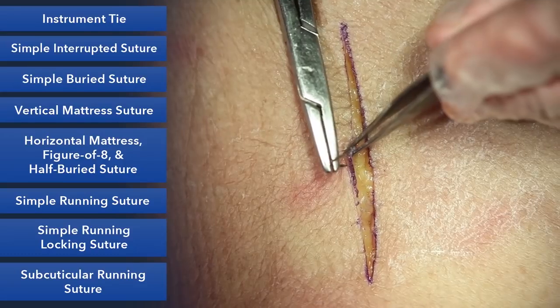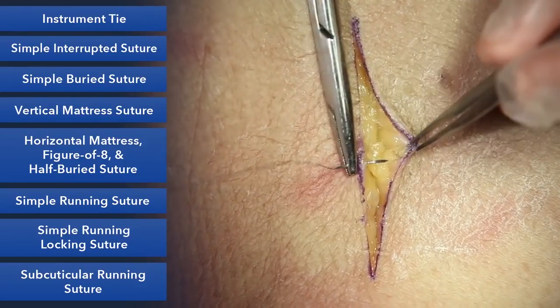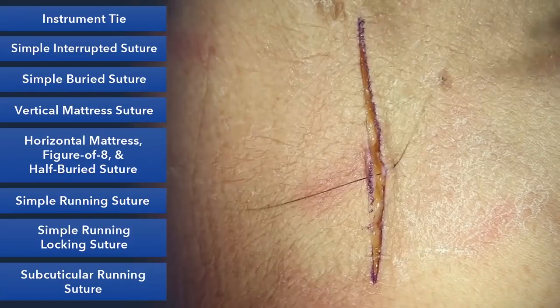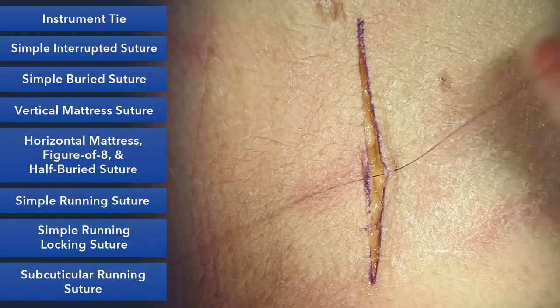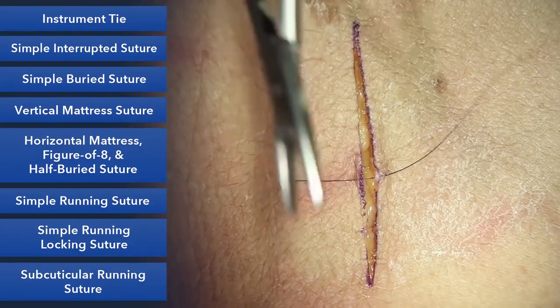For a simple bite, we'll want to enter the skin at 90 degrees, going back a few millimeters from the skin edge. Take a nice bite perpendicular to the skin, and on the opposite side do the same — exaggerate that 90 degrees. If you take it at 90 degrees, the skin edges will evert and come together nicely.